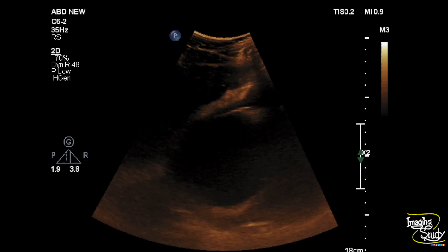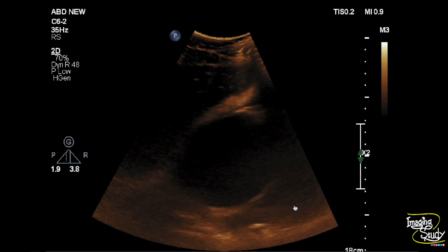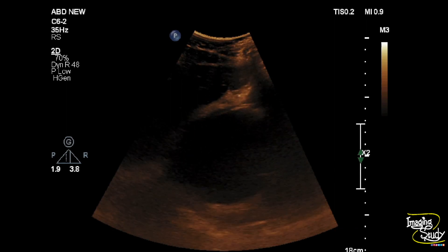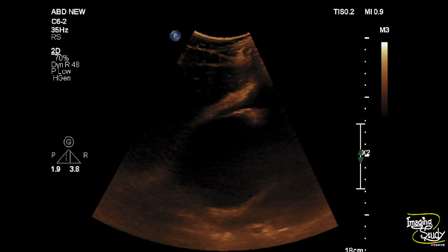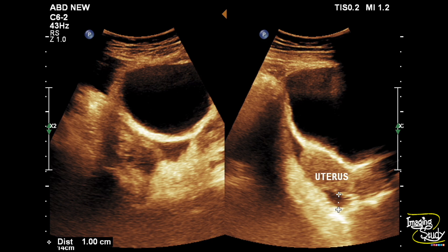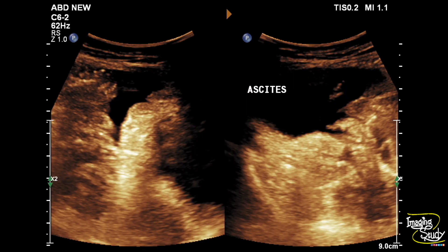Here you can see the right heart and it is moving very slowly due to increased right atrial pressure with right heart failure. In the lower abdomen you can see the urinary bladder, and adjacent to the bladder there is some collection. On the right image you can see the uterus with collection at the cul-de-sac. There is also peritoneal collection visible in the right abdomen.